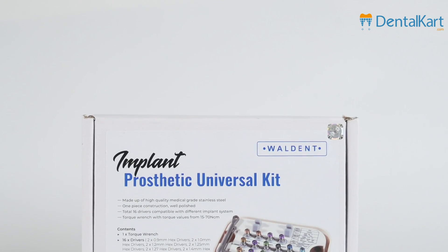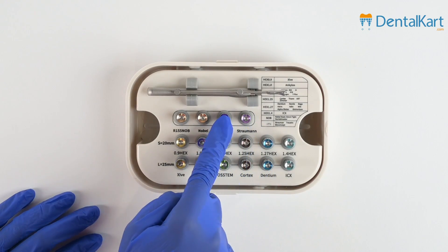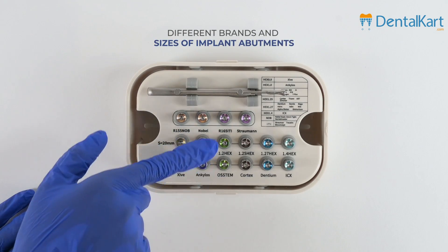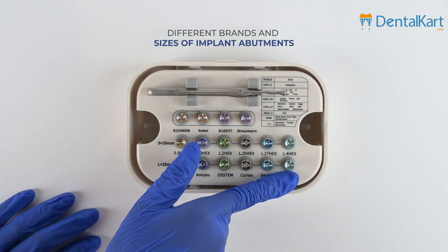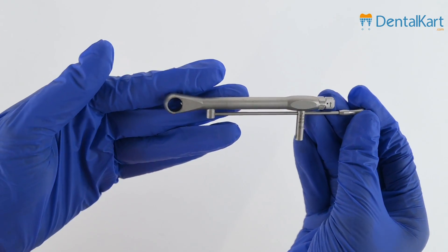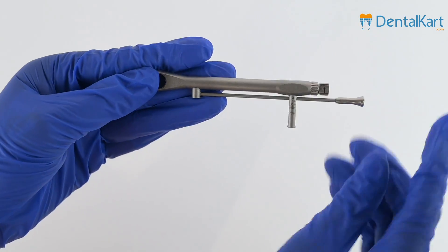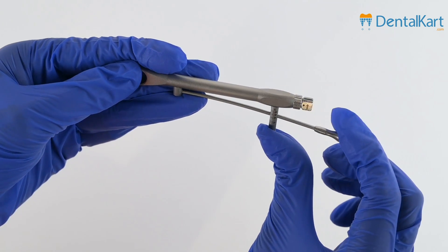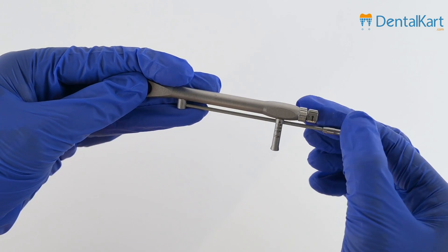The Universal Prosthetic Kit comprises a range of prosthetic drivers meticulously crafted to be compatible with different brands and sizes of implant abutments. Included in the kit is a lever-style torque wrench capable of measuring torque values from 15 to 70 NCM, ensuring precise and reliable outcomes for your implant procedures.